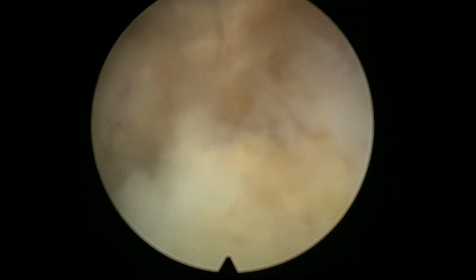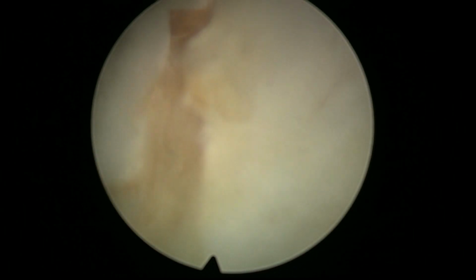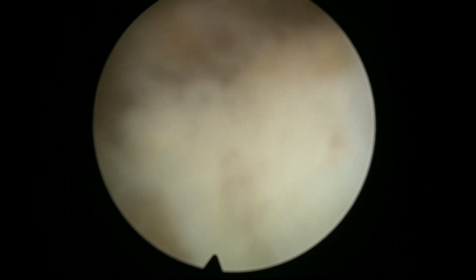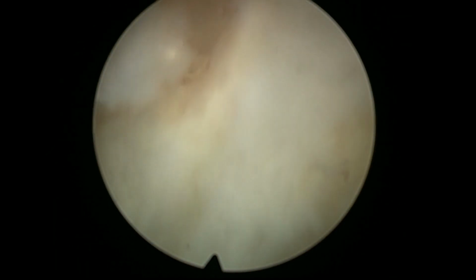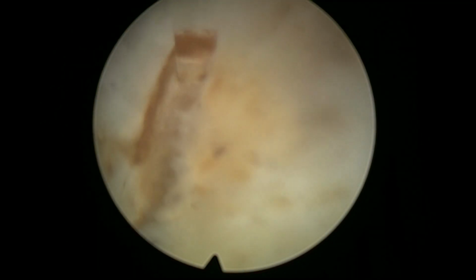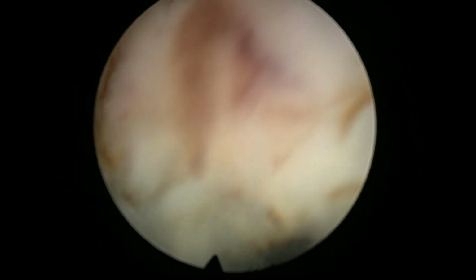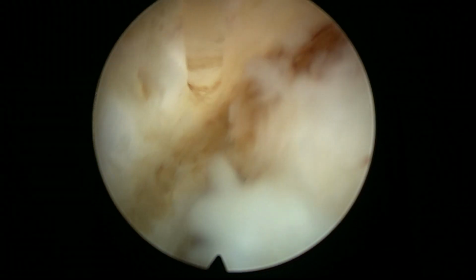You see, sometimes you don't find the good or the best plane, but of course we are doing a cavitative technique, and it'll be better than if we do just a channel. The quality of hemostasis is amazing, and this patient had the catheter removed the following day and went home without any trouble. And yeah, you can see the rigidity of the tissue even up there. How it doesn't look as elastic and as nice as the normal tissue.